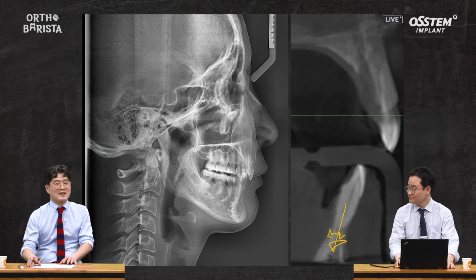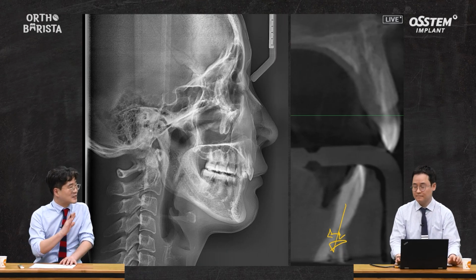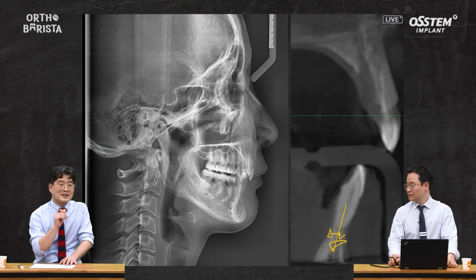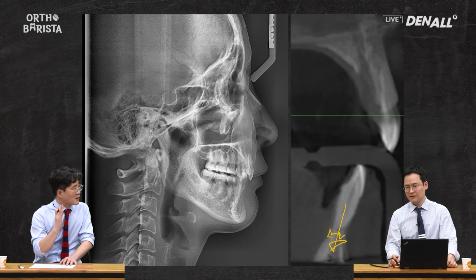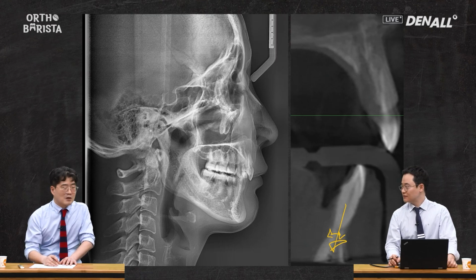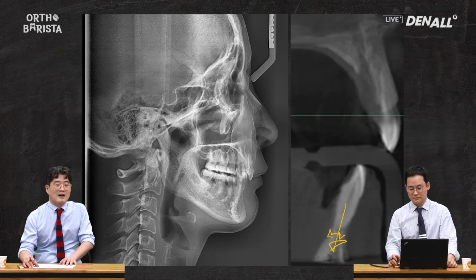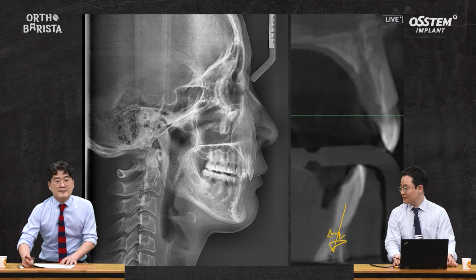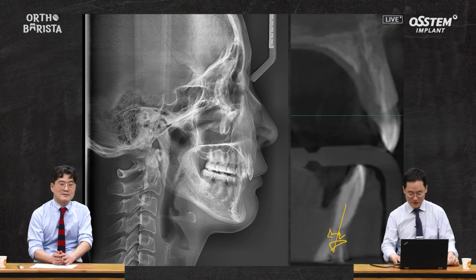This is certainly an important factor. Whether it's the maxilla or the mandible, proper diagnosis for intrusion is crucial at the chairside. For the mandible, the degree of constriction in the symphysis bone is a key consideration. The same applies to the maxilla and mandible. The overall angulation of both the maxilla and mandible, especially in cases like Division 2, can make treatment particularly challenging. Intrusion attempts can sometimes lead to root exposure or other complications, emphasizing the critical role of accurate diagnosis. While there are many factors to consider, I've condensed the easily overlooked aspects to share with you.